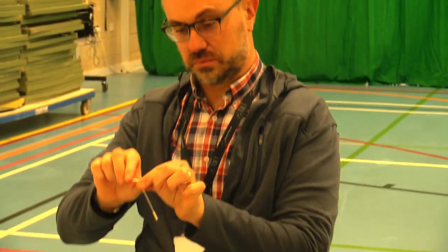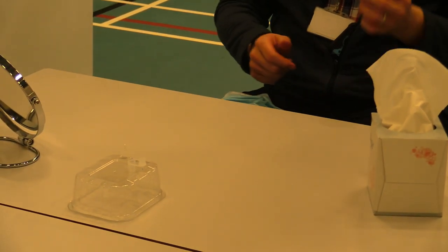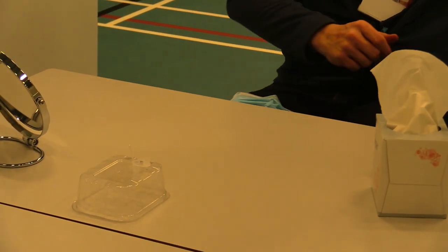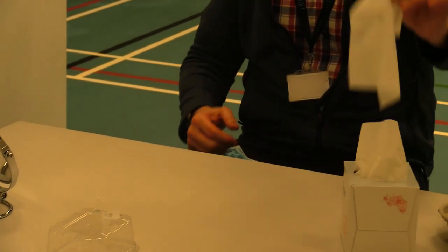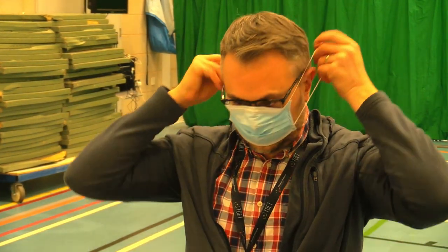Okay, that's sufficient. What I need you to do now is snap it in half and then pop into the test tube provided. If you need to, you can blow your nose. If you'd like to re-sanitise your hands, pop on your mask and you are good to go.